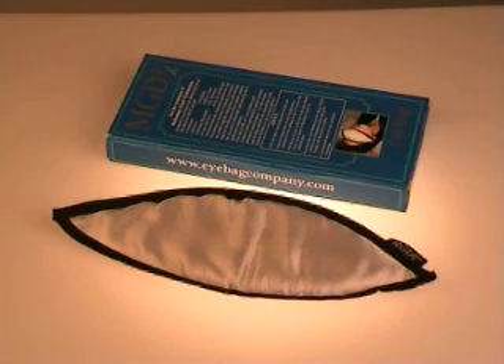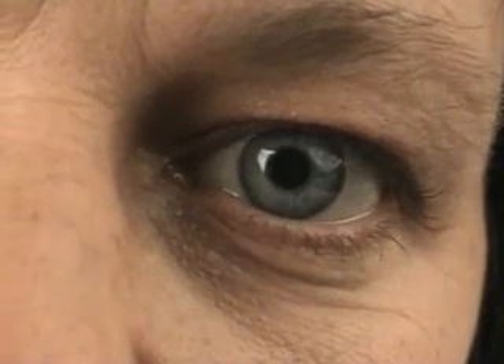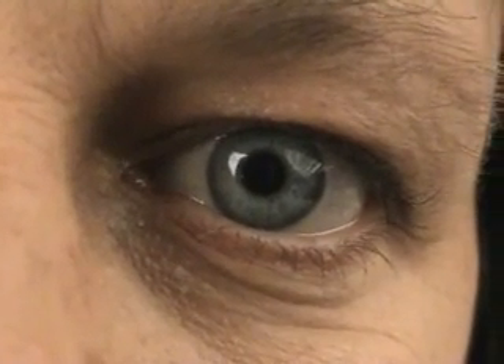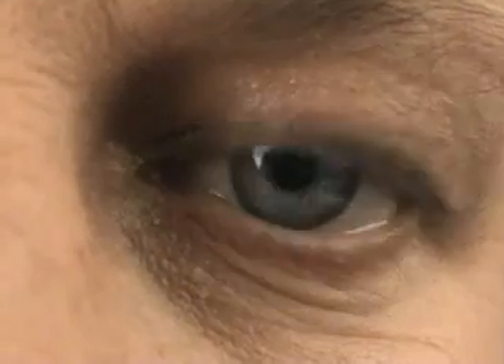I designed the eye bag to treat MGD. Because eye bag treatment is pleasant, simple and effective, patients actually do it regularly. MGD impairs the oily tear film — it changes the oil to a greasy or waxy consistency, blocking the glands and causing further eyelid inflammation. The unstable tear film leads to rapid evaporation of the tears, causing dry eye symptoms.